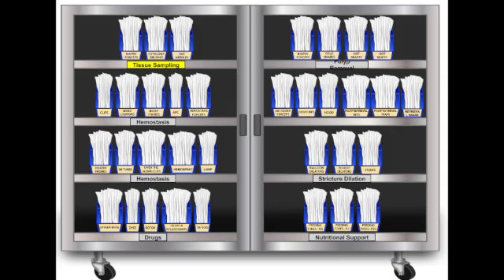So for this deep dive, we're drawing from Dr. Raju's video series, Endoscopy Technology Theory Accessories. Right. That's the source. It's fantastic material that really emphasizes why you need to grasp the function behind every single instrument you pick up in GI endoscopy. Okay, so our mission today is clarity. We want to categorize, analyze this pretty extensive list of accessories, focusing on the specific applications, whether that's for visualization, diagnosis, critical hemostasis, or maybe those more complex therapeutic procedures.